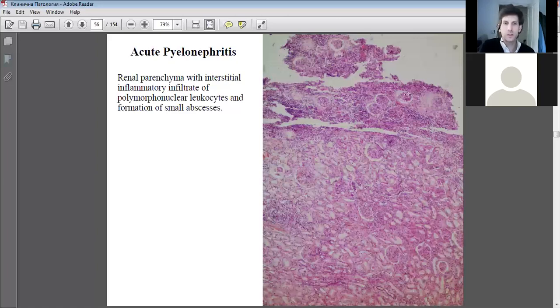Acute pyelonephritis, inflammatory infiltrate, slowing death of tissue, massive loss of glomerular function here. This tissue is really in a serious state. Lots of abscesses. One there, one there, dotted around. This one is a good one here. However, there are some normal tubules still remaining and a normal glomerulus. This top area, though, is really seriously infected.